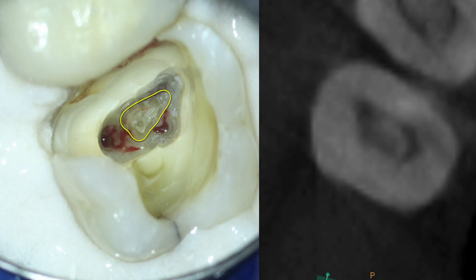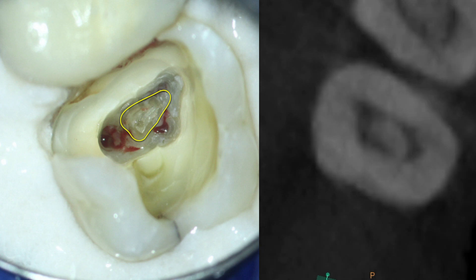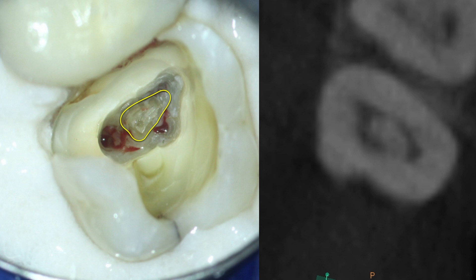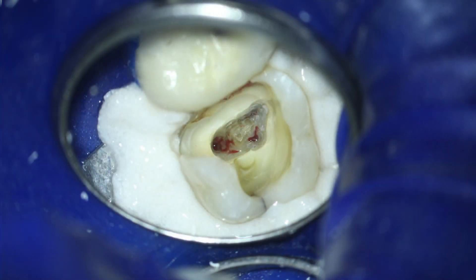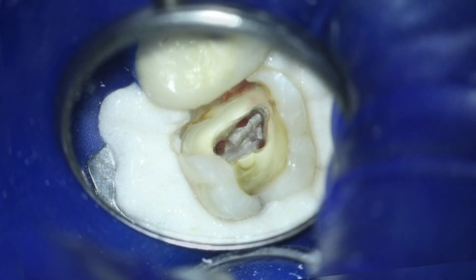We also see right there in the center the more opalescent appearance on the pulpal floor — that's the pulp stone we saw on the cone beam. Pulp stones can flick out sometimes very easily with a spoon or an explorer. Sometimes they're floating in the pulp itself, but sometimes they're pretty tightly bound down to the floor or the side of the tooth. If they don't flick off right away with a spoon or an endo explorer, sometimes we have to use ultrasonics to loosen them, or a burr will also do the same job. I chose to remove this pulp stone with the 557 surgical length burr. After the pulp stone is removed, we have a nice clean chamber and that vital pulp.